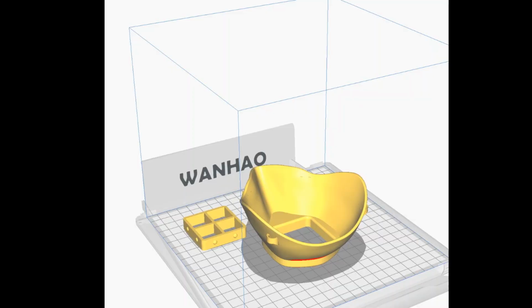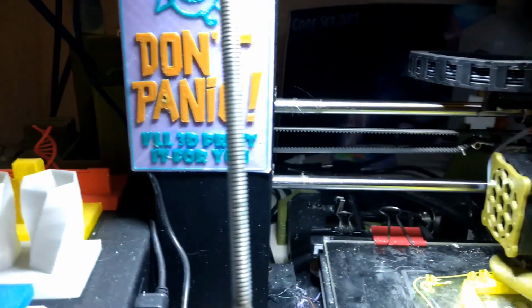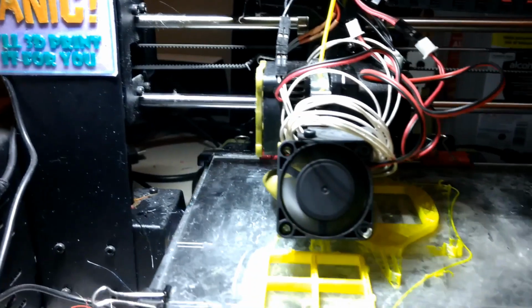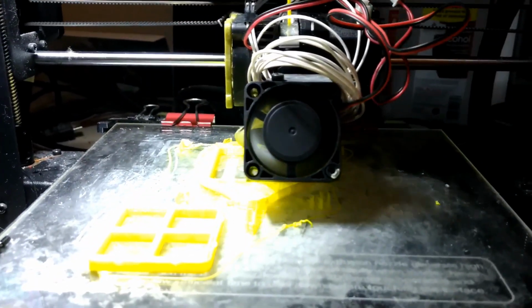Now I took the same design, and instead of using PLA, I wanted to use TPU. So I printed it on my printer at home and tweaked a little bit of the settings to make it work just right for this type of material, and it turned out great.